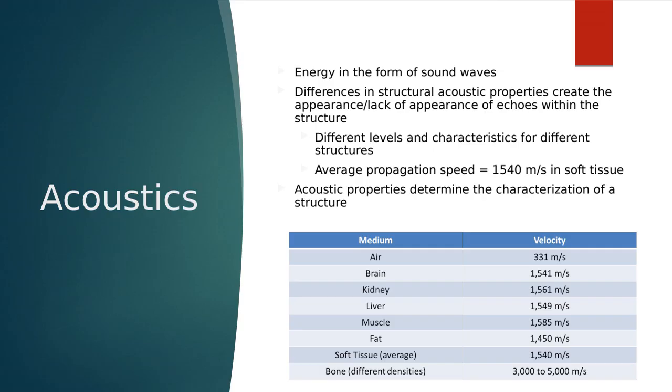Now, we talked a little bit last week about acoustics. We just briefly talked about the term, and that's the scientific way of how we use sound waves and the energy associated with sound waves to create our pictures. We're going to learn all about the science behind that, the physics behind acoustics, how sound waves behave, how we can manipulate our sound waves, all of that in our physics class in the spring. So we're not going to get too crazy with it, but we do have to have a basic understanding of how sound travels in terms of speed.